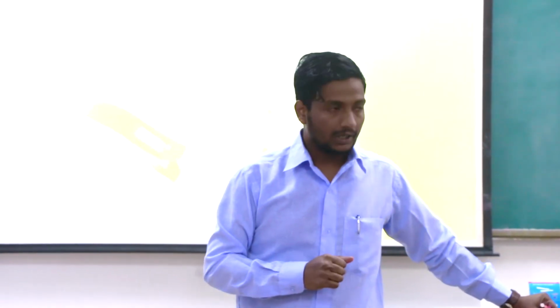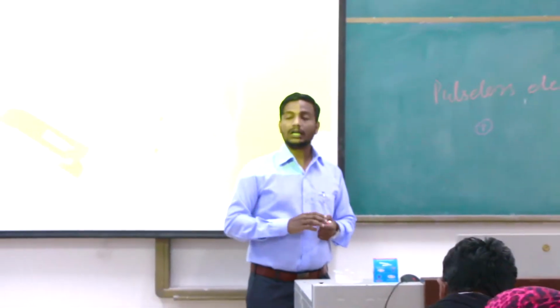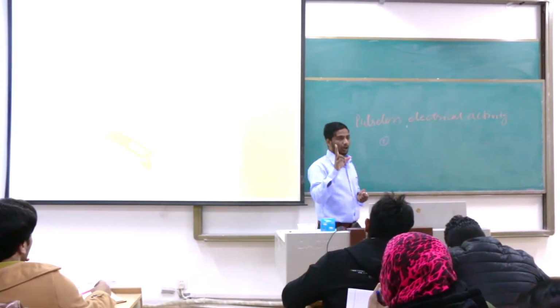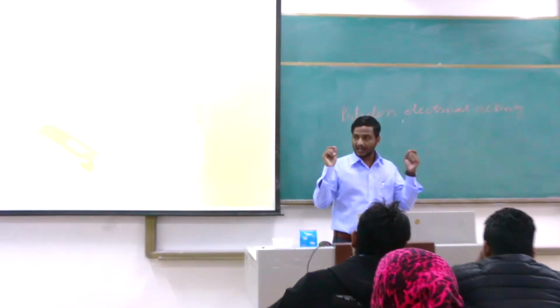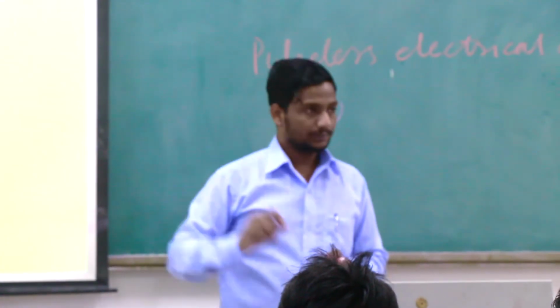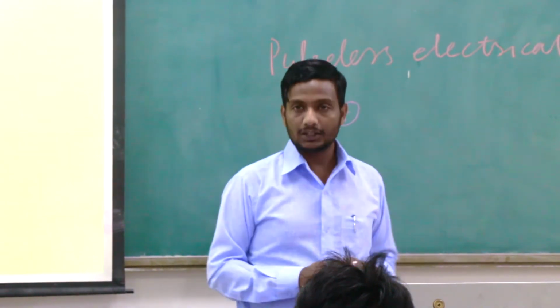Clear to you? Yes. Okay. Now remember, whenever these electrodes are going to record the current, we have to keep two things in mind. Number one, what is the axis of the electrode? And number two, what is the direction of the current?